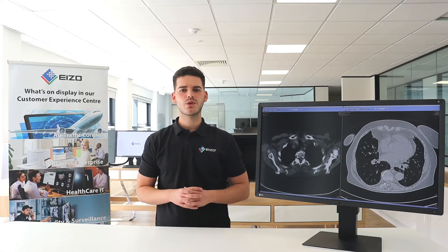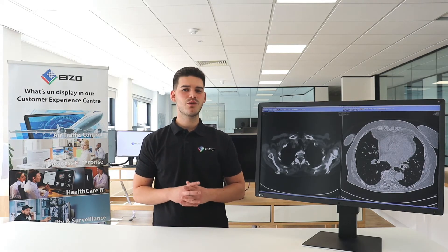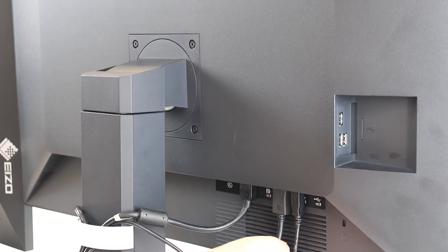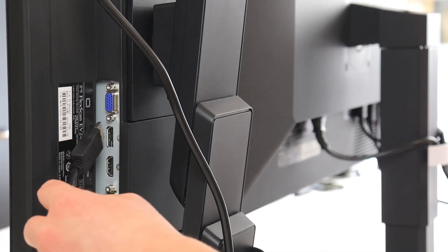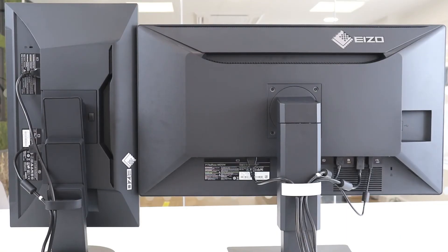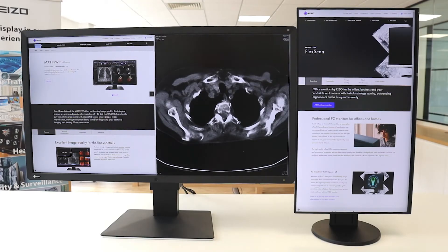The MX315 is equipped with DisplayPort 1.2 input and output terminals. Using a single cable connected to the input terminal, the monitor displays the 8MP resolution. Using the DisplayPort output connection, you can drive several monitors in what is called a daisy chain sequence. This allows you to configure a multi-monitor setup using just one output from your graphics card without the complicated hassle of excessive cabling.